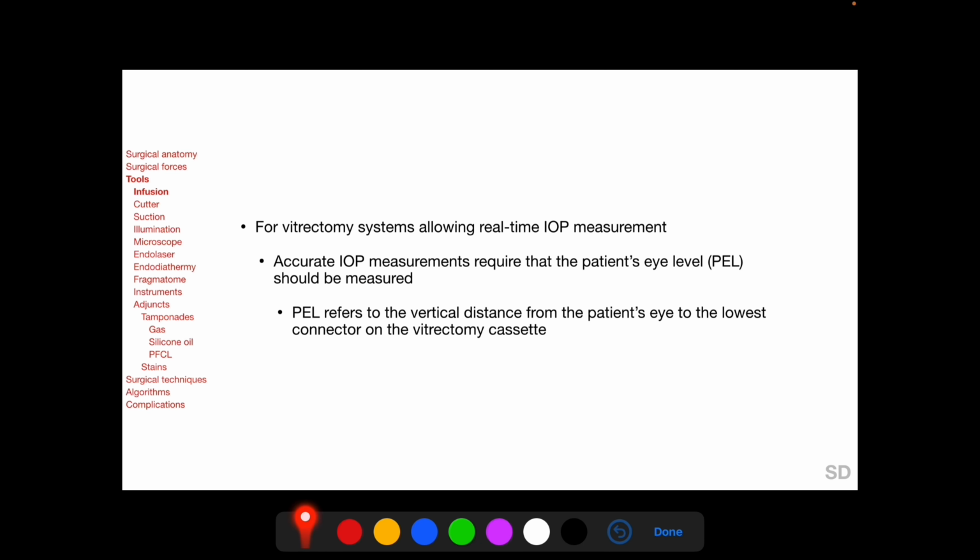Uses of intraocular gas include occluding retinal breaks and tamponading detached retina during and after vitrectomy for retinal detachment and macular hole. But in addition to vitrectomy, intraocular gas can also be used for pneumatic retinopexy to treat selected cases of retinal detachment, as we will be discussing in the next session, and in certain situations during or following scleral buckling. Intraocular gas can also be used to displace submacular hemorrhage away from the macula.